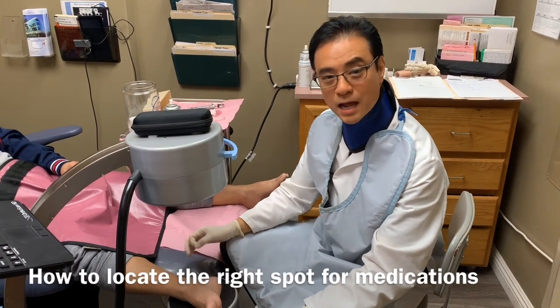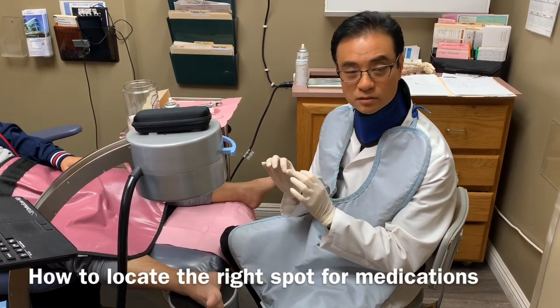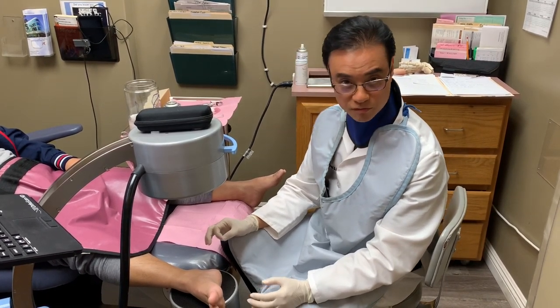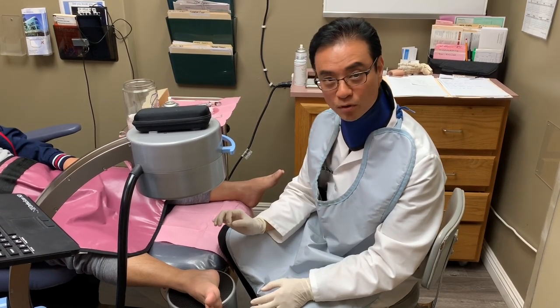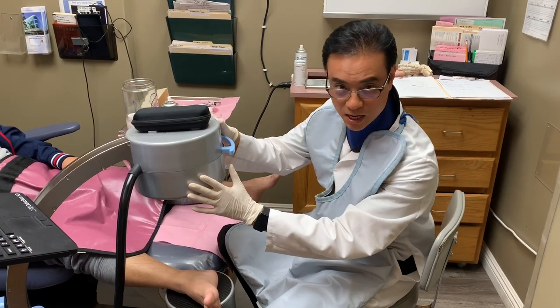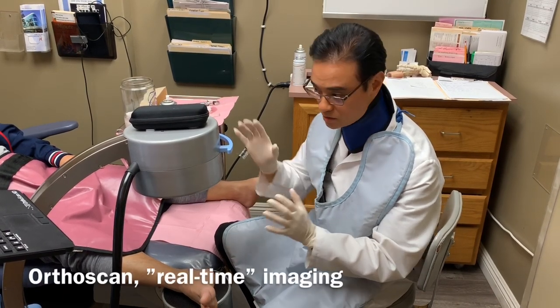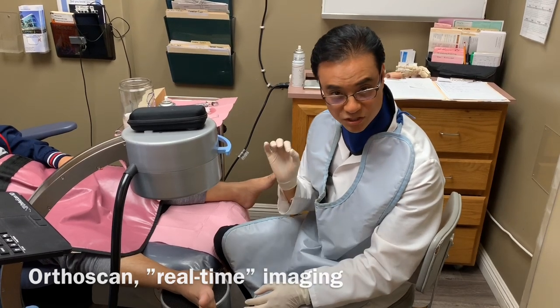Today I'd like to show you exactly how I put the medication into the right spot on the heel when I do inject for the heel condition. This is what I struggled for many years to find out — exactly where to put the medicine. It's very important, and even myself, when I did it without this machine, I was wrong about 50% of the time on the exact location where to give the injection. So I'm going to show you how I put this machine on the foot so I can put the injection exactly where I want it.